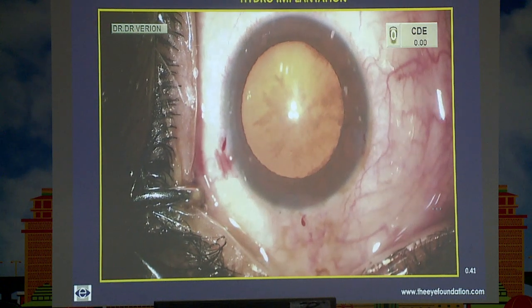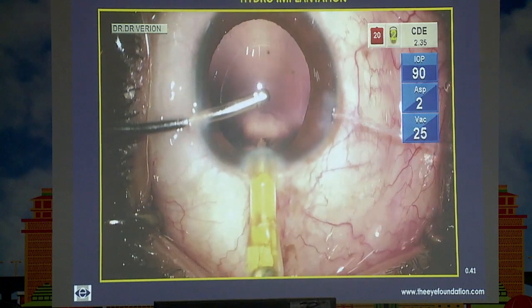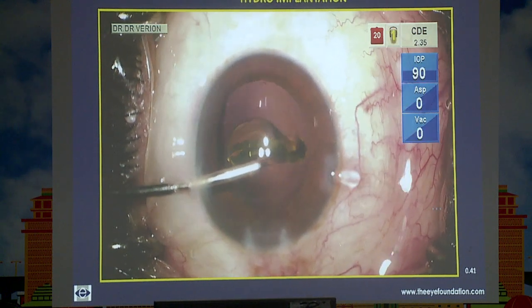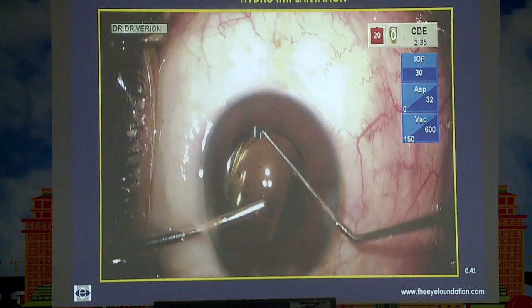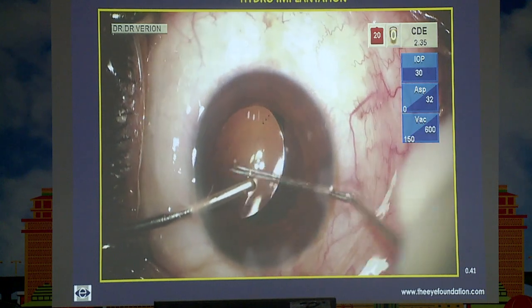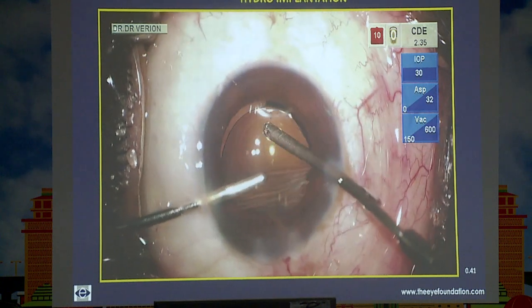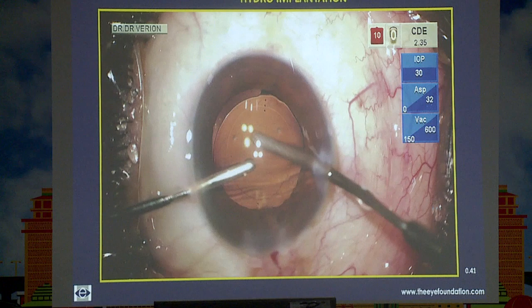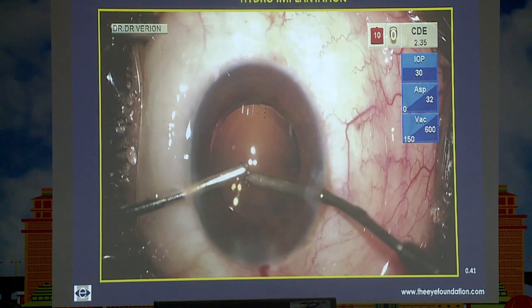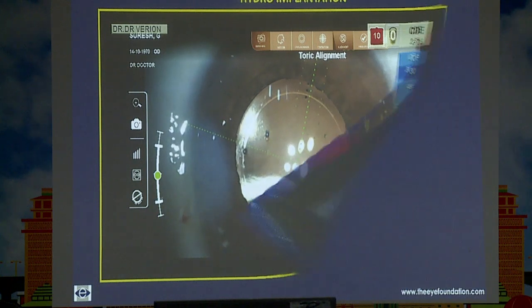And nowadays what I do is hydroimplantation, where basically once the nucleus has been taken out, we just have the irrigation cannula in place, and you can see this. I specifically chose this video because you can see the lens appears to be a little uncontrolled, but even in these cases you can manage them quite well, position them accurately, and then with just the irrigation flowing, you can position these lenses very well. So that does away with the variability of having to remove the viscoelastic completely, and usually what you find is the way you left the lens is the way it remains postoperatively.